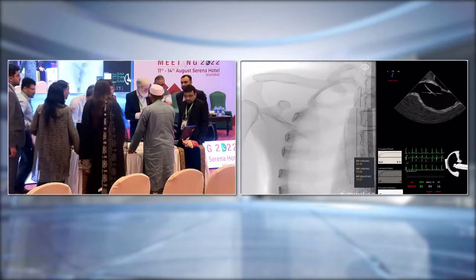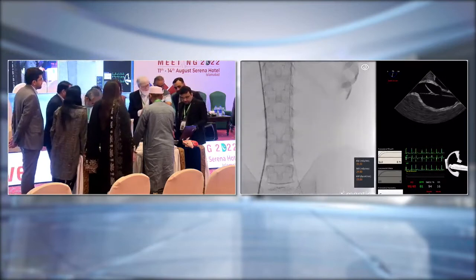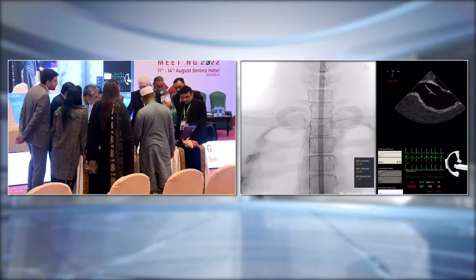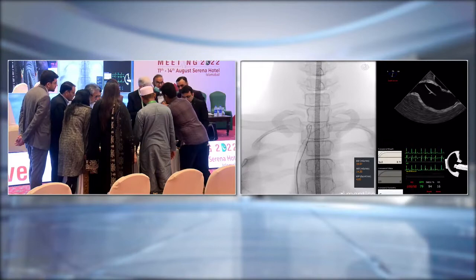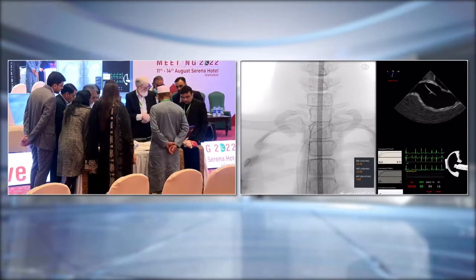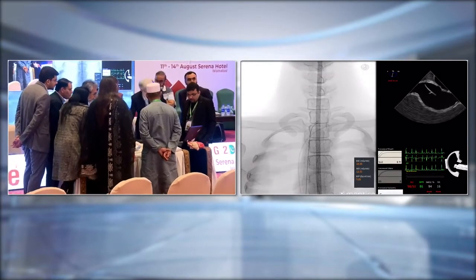ये जरा इसको नीचे लाएं दोबारा ग्राउंड में. This is the Mullen shape. हाँ ले जाएं सर, मोलन ले जाएं. इस को दिखाते जाएं मोलन. नीचे है बस ठीक. वायर होल्ड है सर. ठीक हो गया. थोड़ा नीचे करो, टिप दिखाओ.